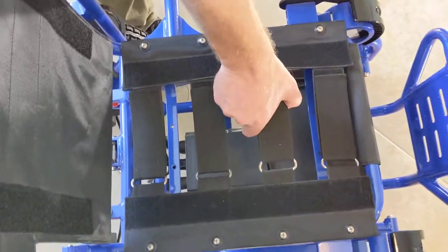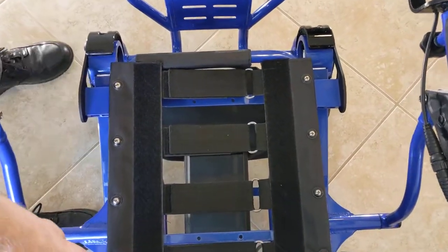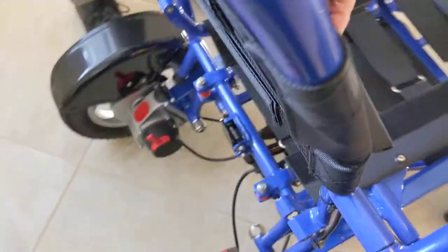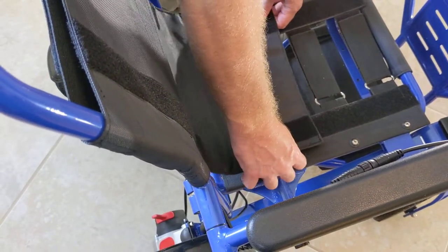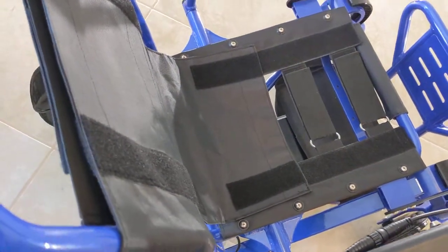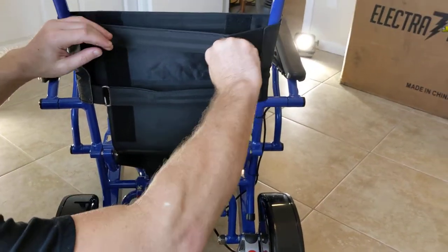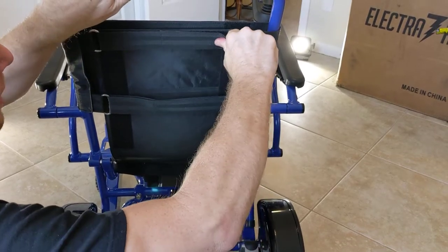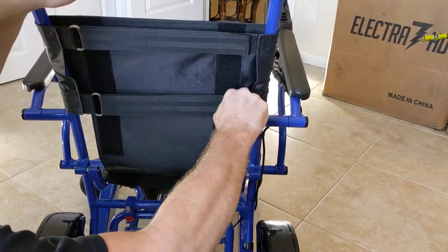A lot of people don't understand that the harness gives you a lot of flexibility to make the seat very firm or very soft. The back of the seat has a flap that's folded underneath the chair, and you have space in between the frame. This is designed to be unfolded to give you the level of lumbar support that you feel more comfortable with.